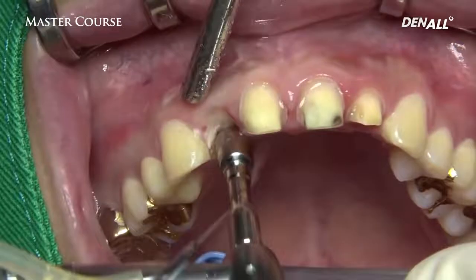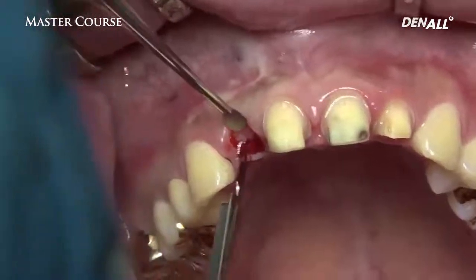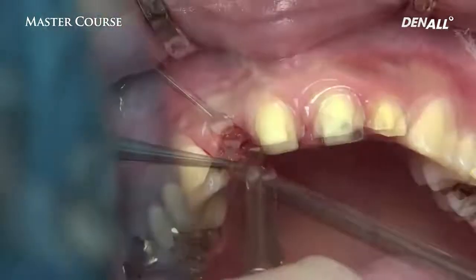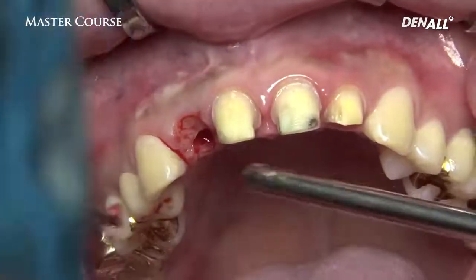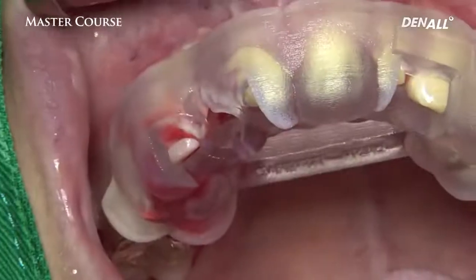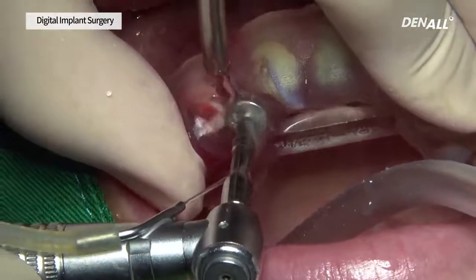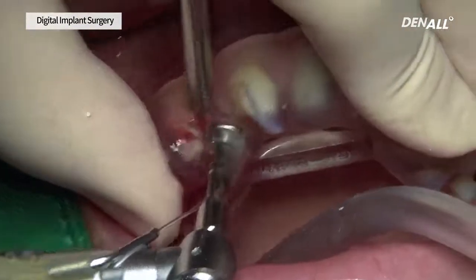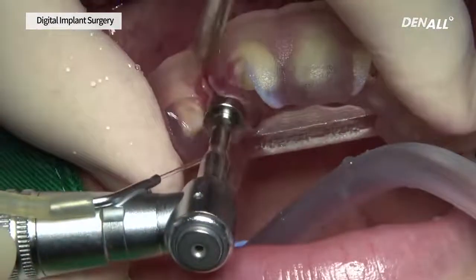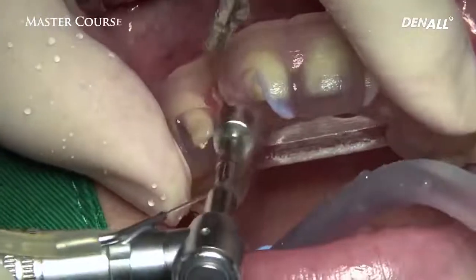So flapless surgery is planned for placing implants. By doing the flapless surgery, we can position the implants as planned, and for that, the best solution would be One Guide surgery. A tissue punch is used to remove the top tissue. After mounting the Osstem One Guide template, sequential drilling is performed.